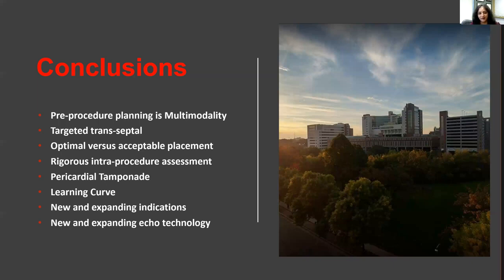And what I've also really enjoyed about it is the new expanding technology. Echo technology has definitely improved and is really geared now towards structural cases. And I've tried to highlight some of the newer technologies in this talk.